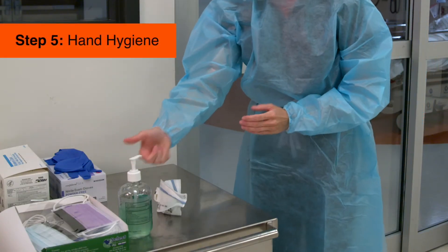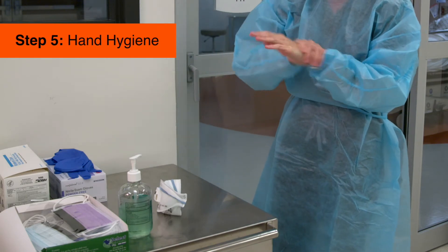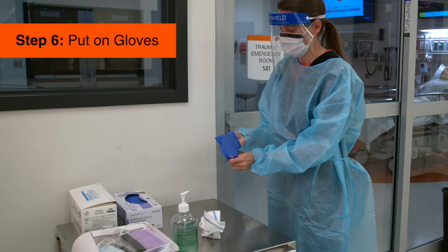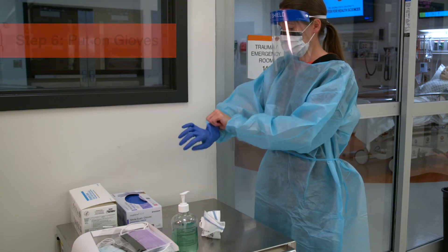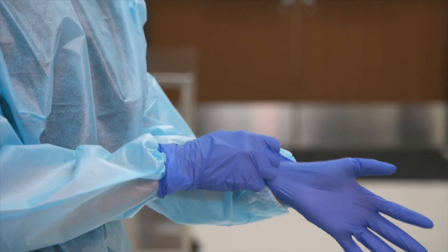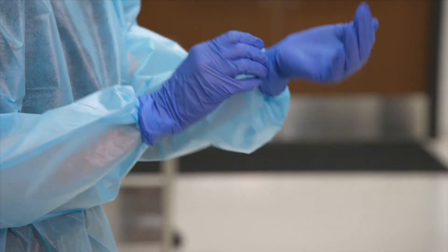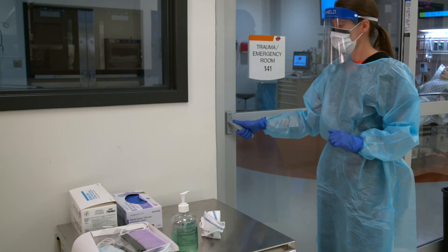Once again, perform hand hygiene. Lastly, put on your gloves. Pull the gloves down so that they cover the wrist of the gown.